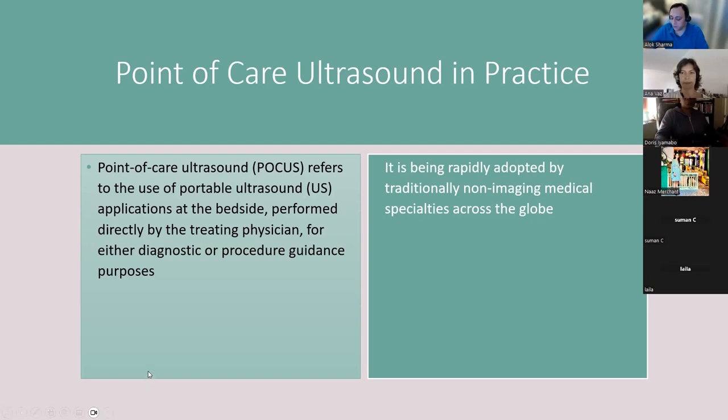The important aspect of trying to introduce point of care ultrasound is that this explosion is traditionally cross-specialty. Cross-specialty means we have people in pediatric emergency medicine using point of care ultrasound. We have our colleagues in pediatrics currently using it for vascular access. I know in Southampton, where I was working, our PICU and pediatric colleagues would use an ultrasound even for normal cannulation. And for difficult PICC lines, it's been introduced and nurse practitioners have been trained to use it in Southampton, which is fantastic. But early steps and inroads into the neonatal unit are also making rapid advances.